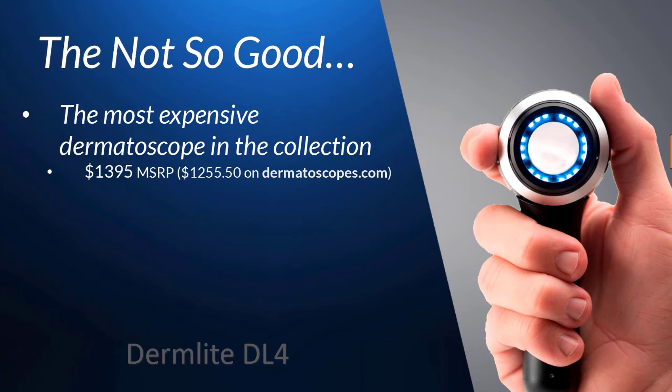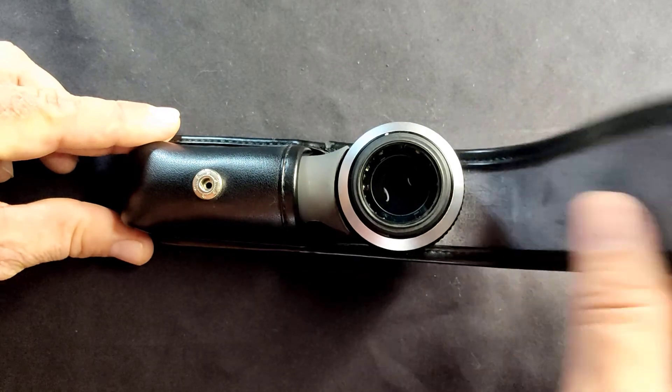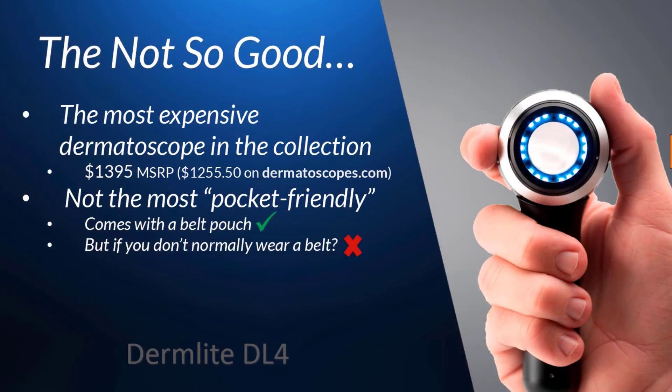Besides the price, I would have to say that it does share some of the not-so pocket-friendly issues of the DL3. Again, it's overall more compact compared to the DL3, but if you aren't using its belt pouch and instead have to rely on keeping it in your lab coat or pants pocket, you may still find it to be a bit bulky or awkward to carry around.